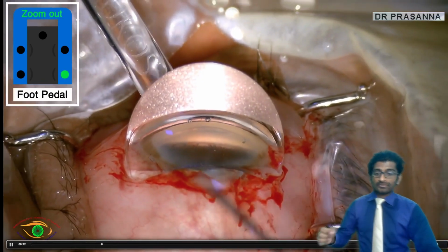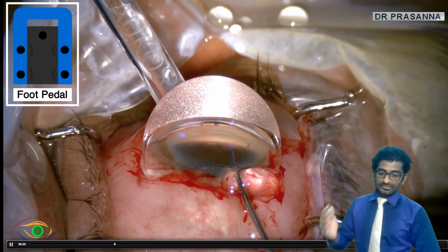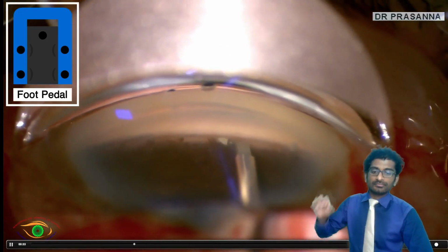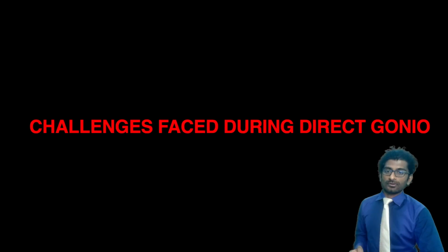Why do I zoom out? I zoom out because I want to identify the main incision and then take my surgical instrument, whatever MIGS I am doing, through the main incision for the successful procedure, and again I zoom in. So this particular algorithm really works well, and the left leg plays a very important role.